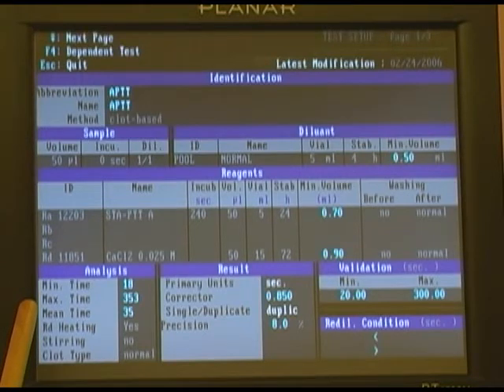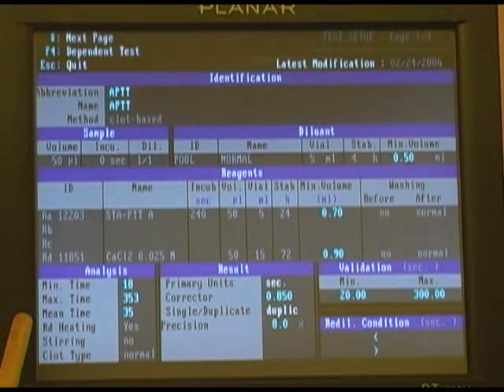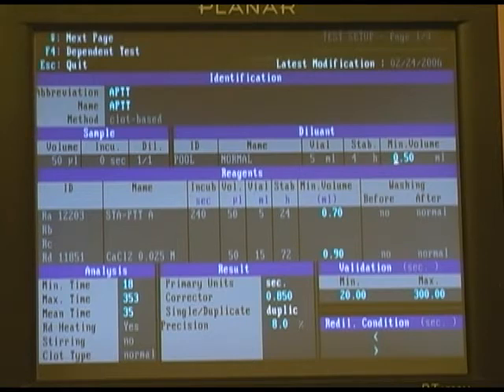Any test that exceeds 353 seconds will also generate an error. The mean time for this particular test is 35 seconds, and we use that to calculate throughput on the instrument.